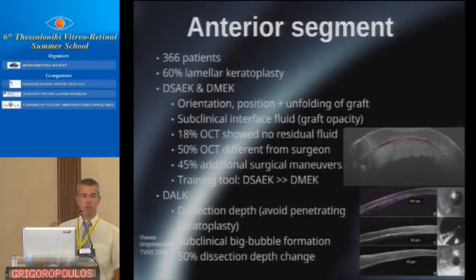So with the OCT, they were able to check how much fluid there was, and they found that in 18% of cases, when the doctor thought that there was fluid there, the OCT showed that there was no residual fluid. And in 50% of cases, so 1 in 2, the OCT showed that the situation was different from what the surgeon thought.